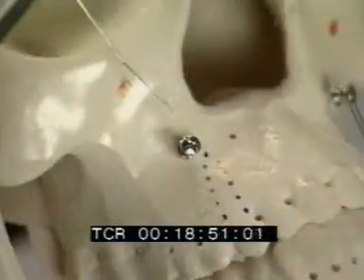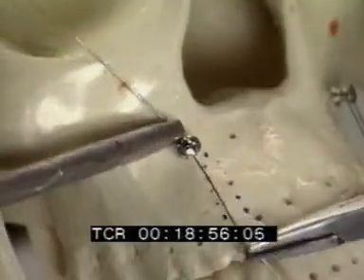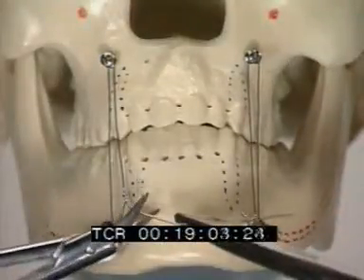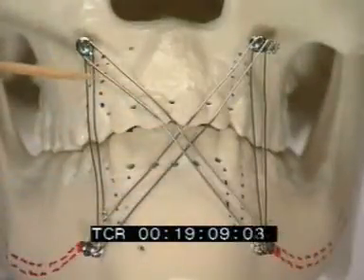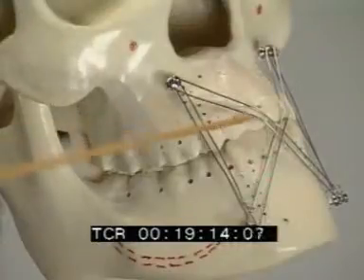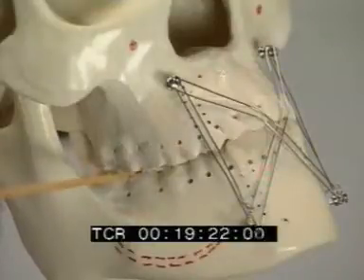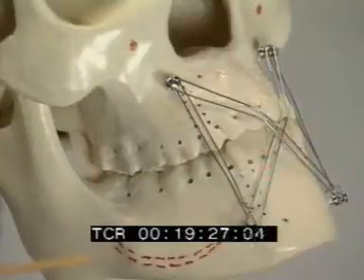Another wire is placed on the other side, this time through the hole in the upper screw and around the lower screw. For more stability, wiring in an X pattern can be added. The results reveal some problems. Tightening the wires may create a posterior open bite, but additional IMF screws or Ernst ligatures placed on the posterior dentition may prevent or correct this condition.